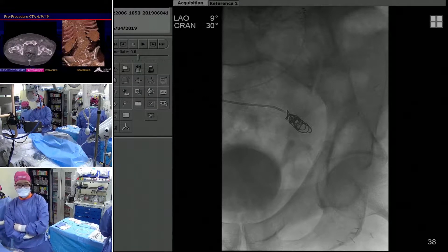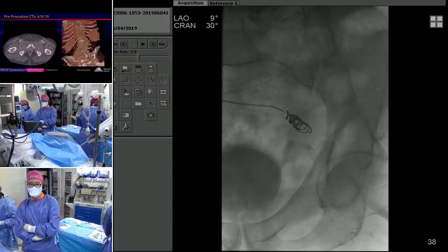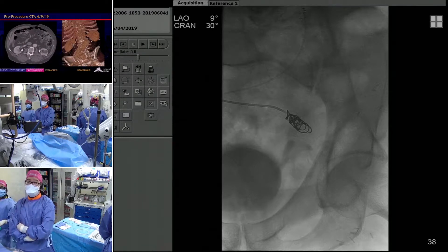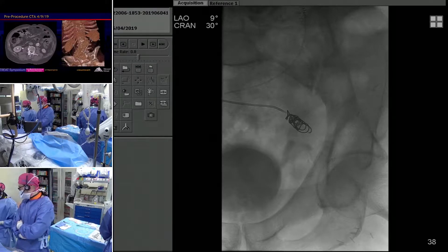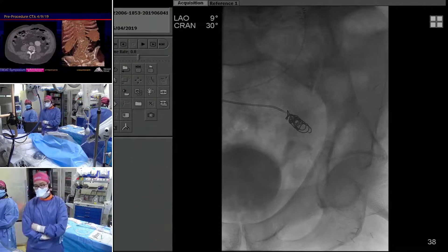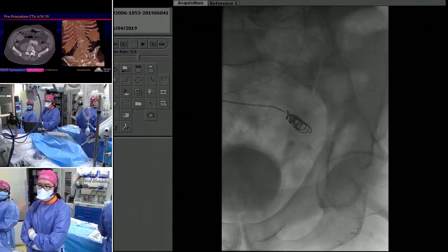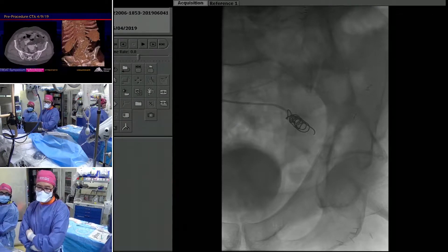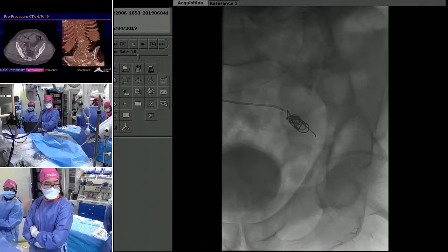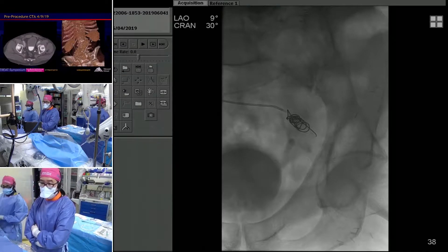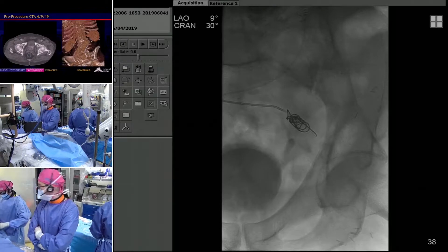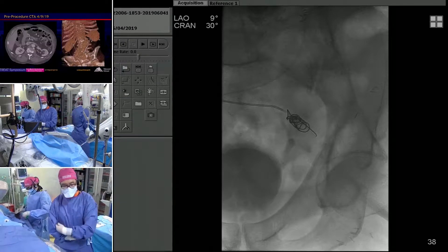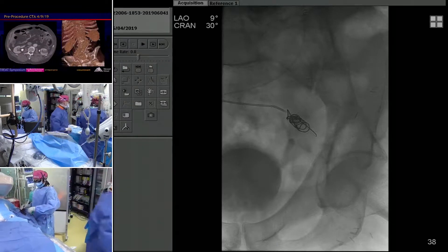Fairly standard from this point on. The main discussion points were really how far do we take this out. We are at the bifurcation point — this is where we'll go ahead and start our coil mass and coil all the way back to the origin of the hypogastric. The tricky part will be visualizing the origin of the hypo. Do you guys want to zoom in on the coil as you deliver it? I think a lot of people in the audience are not familiar with this coil — it's relatively new.